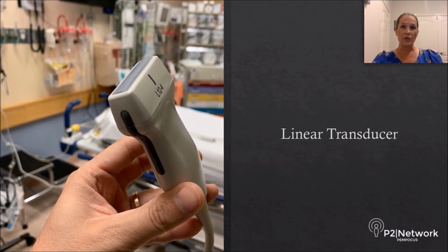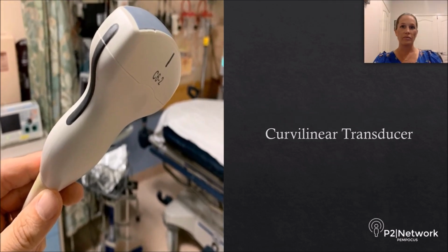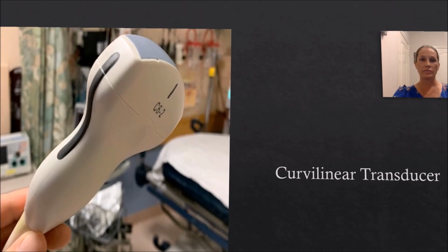Typically, a high-frequency linear transducer is used due to the superficial location of the structures. In larger patients with thicker soft tissue layers, the lower frequency curvilinear transducer may be necessary.